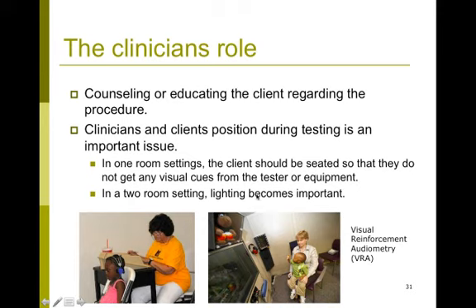In a two-room setting, lighting again becomes important. Like in this instance, the audiologist is doing a procedure known as visual reinforcement audiometry. Here they're reinforcing the patient's turn towards the sound speaker where the sound is coming from by a lighted doll box over here. Lighting is important in the sense that the patient shouldn't be able to see the tester and get cues from the tester regarding when the tone is being presented.